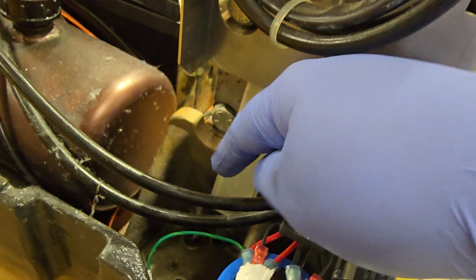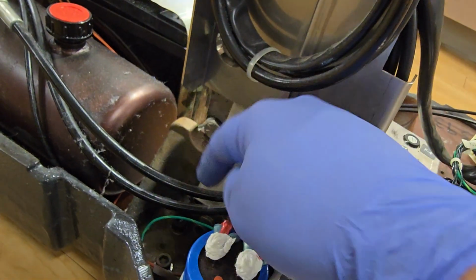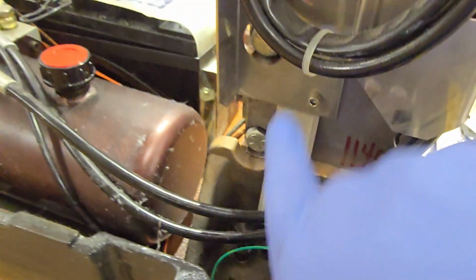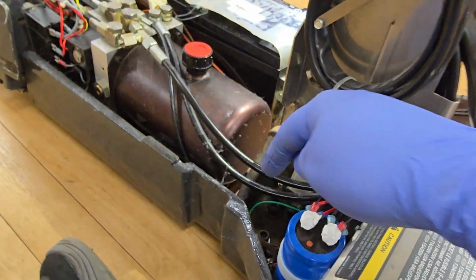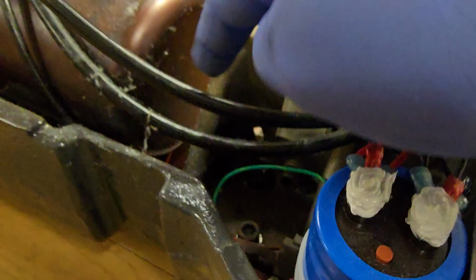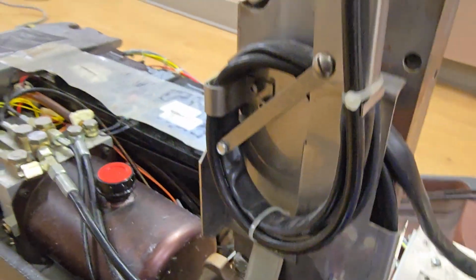I always check the fastener down here on the casting to make sure. You shake the table and then put your finger down there, or get a flashlight and look at them really carefully. You can see we got two fasteners down there, and then there's a couple of them on the riser. You want to make sure that those are tight, because if those ones come loose, then they will tear at the cast material and that destroys your table.